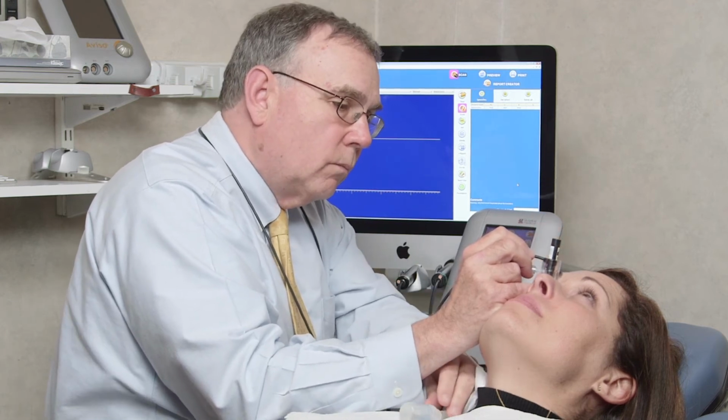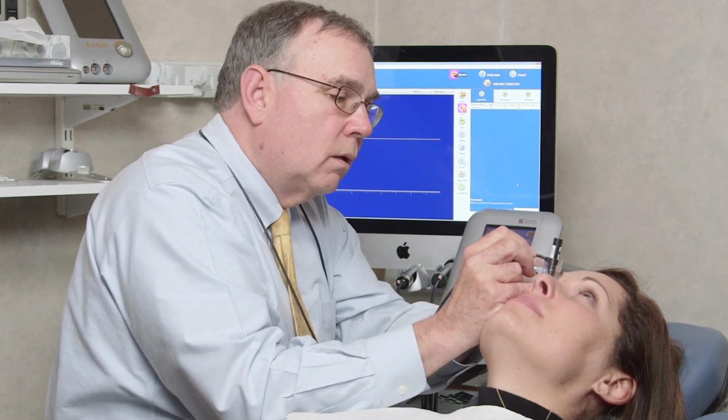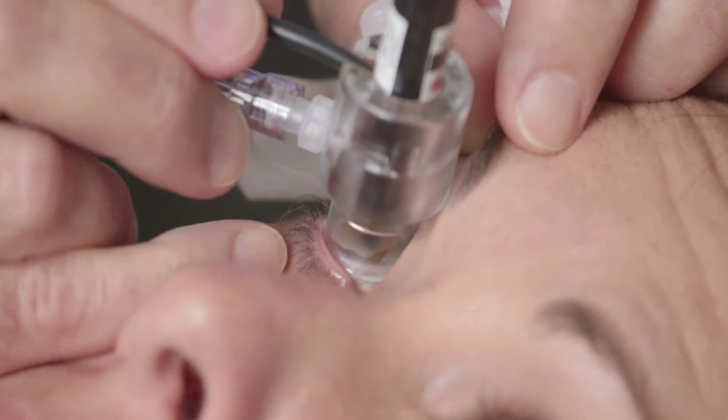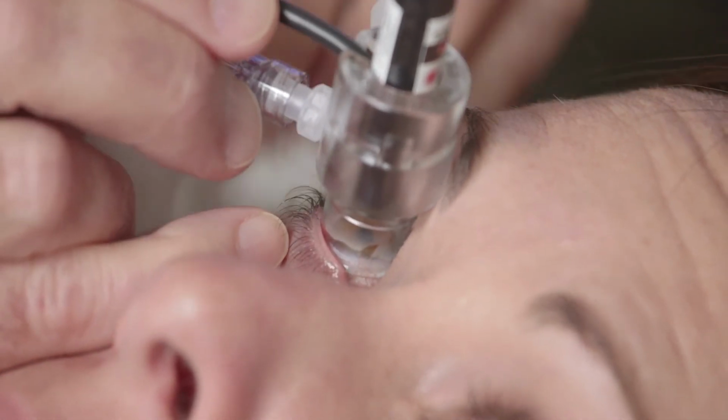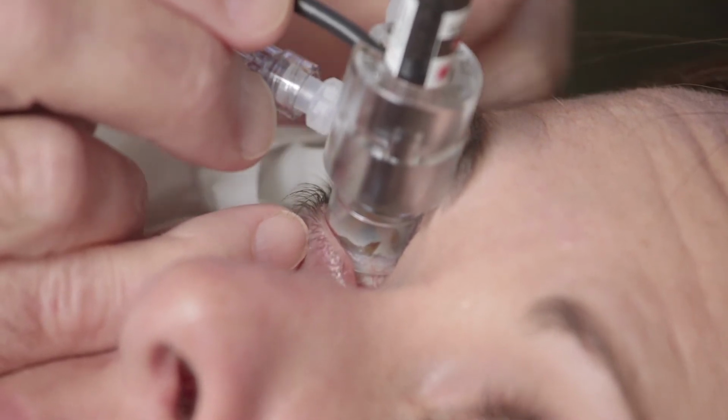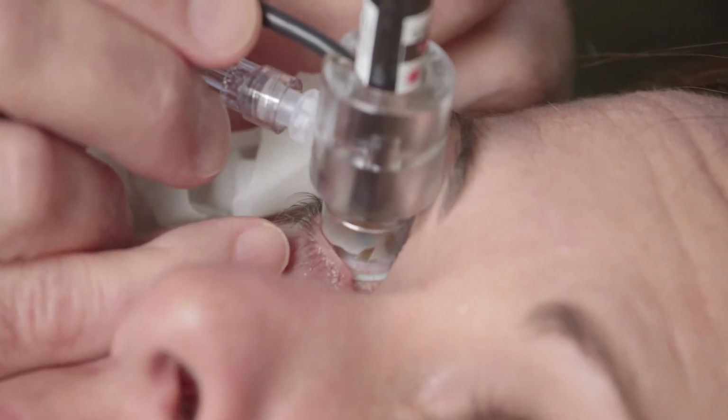The contact method is often considered the easier way to perform biometry, but its essential pitfall is that touching the probe to the cornea can cause compression of tissue, resulting in an axial length measurement that is falsely low. Such discrepancy can contribute to errors in IOL selection and suboptimal post-operative refractive outcome. To minimize corneal compression and error, contact of the probe on the eye should be very light.